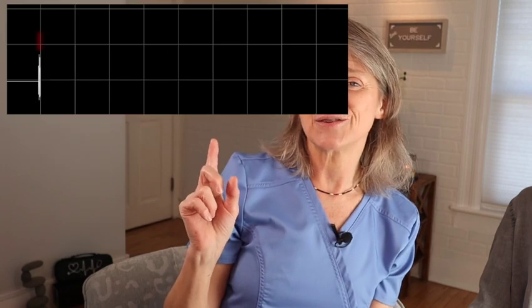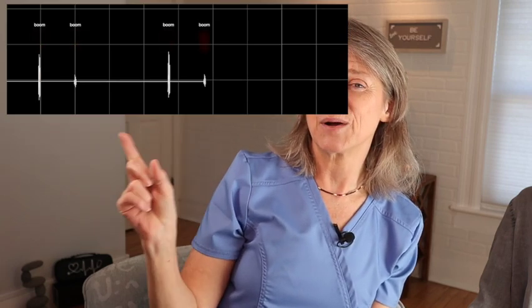Topic number three, heart sounds. When you listen to heart sounds, you will hear this kind of bump, bump, bump, boom, boom, boom, whatever you want to term. And I'm going to use boom, boom because I think it's easier to, I don't know. Does it go boom, boom? No. It goes bump, bump. But how do I spell that? So I'm going to use boom, boom. And a little animation here shows you boom, boom, boom.